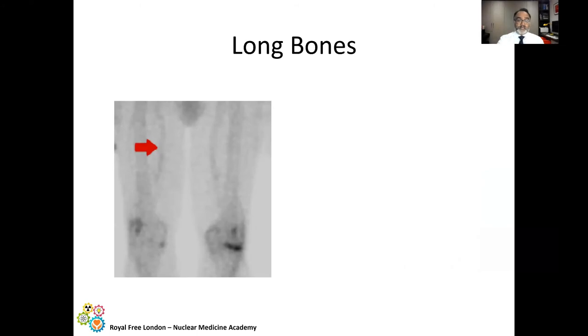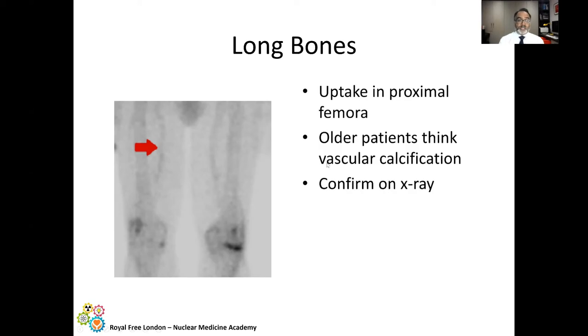This is a subtle finding that you may notice on some patients, particularly older patients. And again, this is soft tissue uptake. So this is calcification within the artery. If you're seeing this, particularly in an older patient, it could be confirmed on an X-ray, but it's likely to be calcification within the vessels.